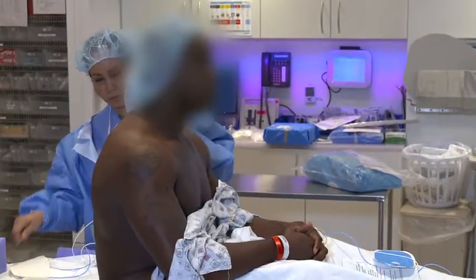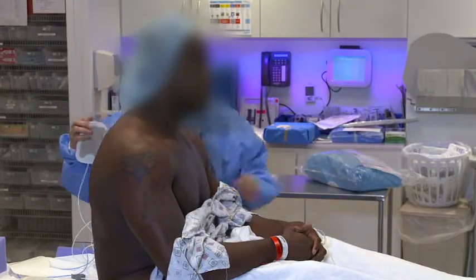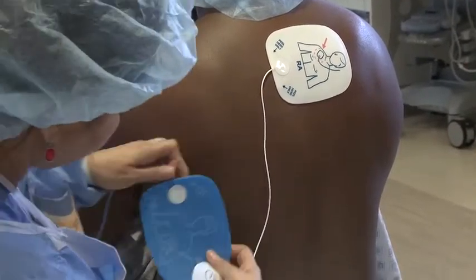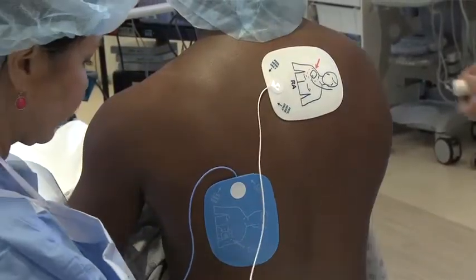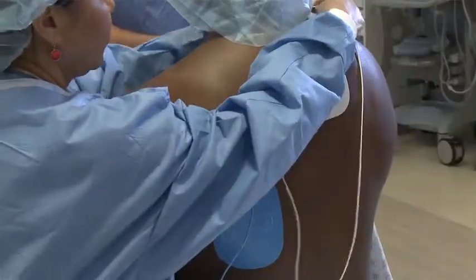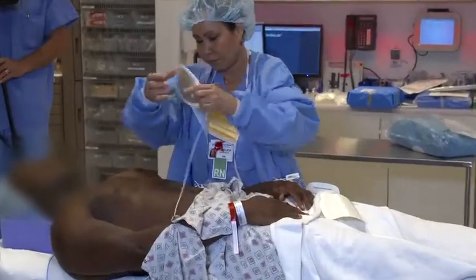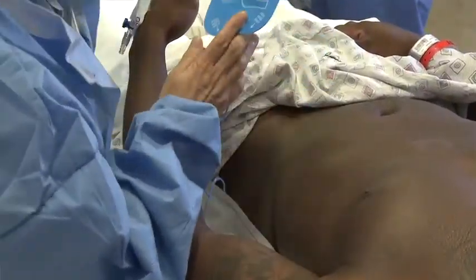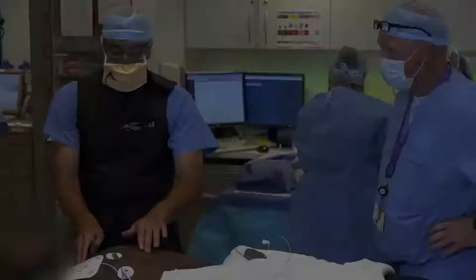We are applying the defibrillator pads — the external defibrillator, also known as R2 pads. We're going to have to make some compromises based on the location of the sub-Q system, so we can't go with the traditional AP configuration. They are going to modify the placement of these pads so that the shock vector is still effective and yet stays out of the prep field for the SICD.